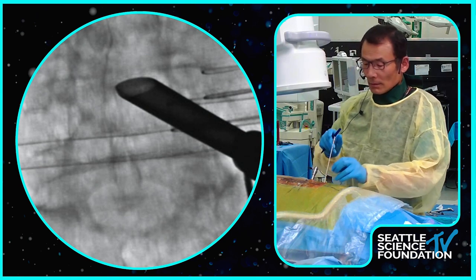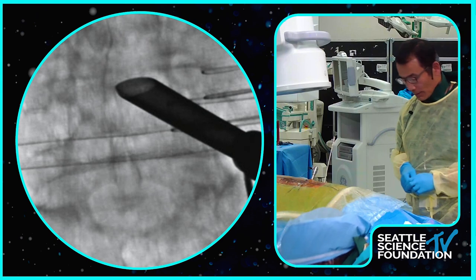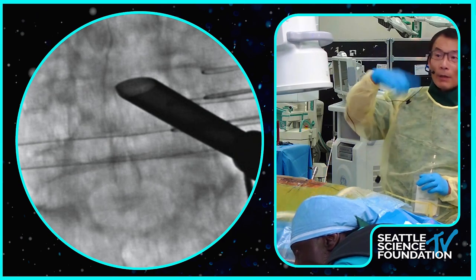Just so everyone's aware, he has a scope on the above level because that level is already prepared. Just for the interest of time, we have that scope already ready. But I think he's going to show the bottom level first, just to line up.